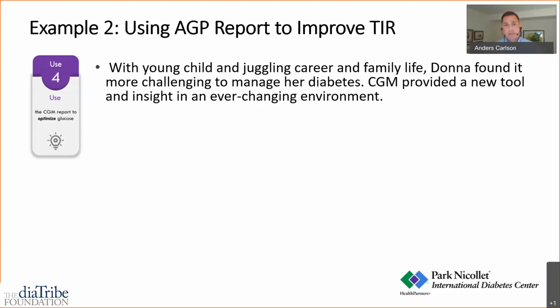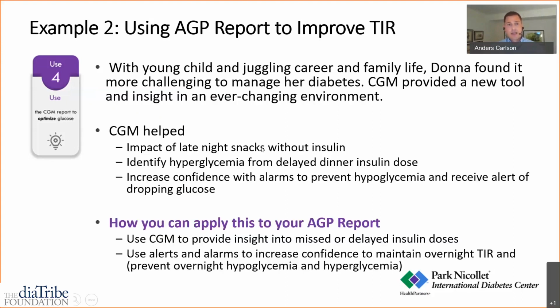So we got to really give her insights into that. And so the CGM helped her see the impact of that late night snacking, find that hyperglycemia around dinner, and work to change when she took her dose at dinner.